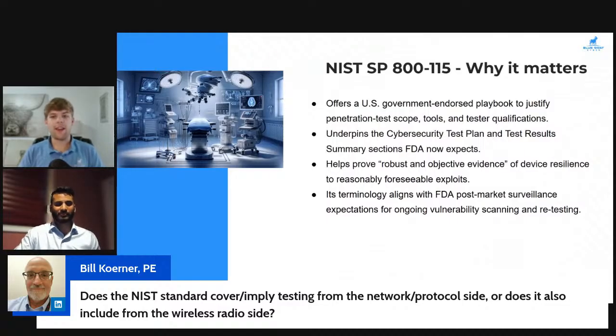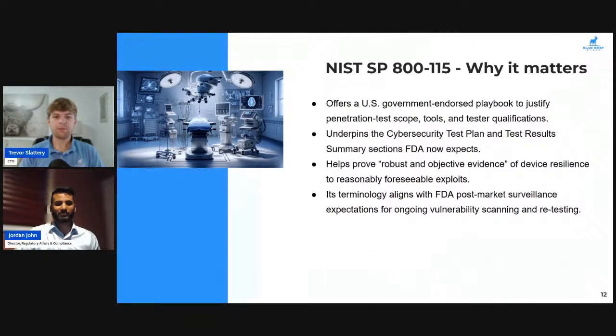And I think that last phase is definitely something that we've seen come up from the FDA in the past, and we've handled this situation before, where there'll be a certain timeline that the manufacturer needs to adhere to for their submission. And so they'll go to the FDA and say, hey, we had this initial penetration test done. Here's our plan for remediation. We'll get to it before the submission is finalized, before the device is out on the market. And they may expect that to be sufficient evidence for the FDA to approve them.